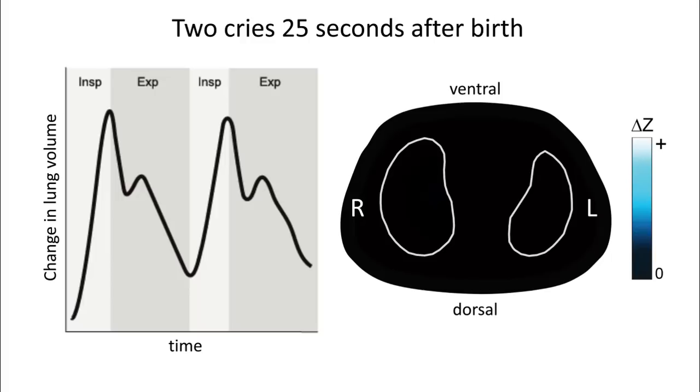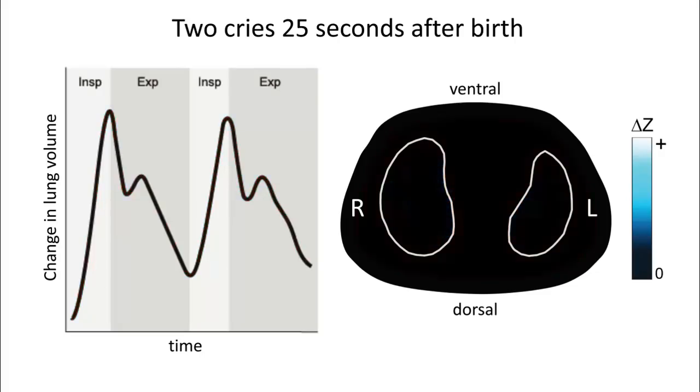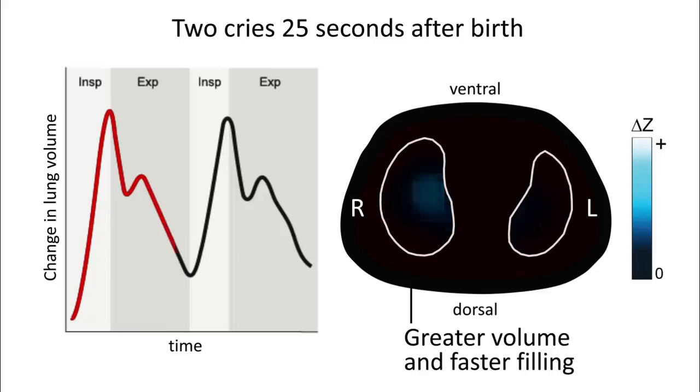The breathing pattern and resultant lung volume changes are markedly different when a baby is crying at birth. Here is shown in two cries 25 seconds after birth. Inspiration is quicker and volume changes greater in the right lung, which also fills with gas faster than the left.